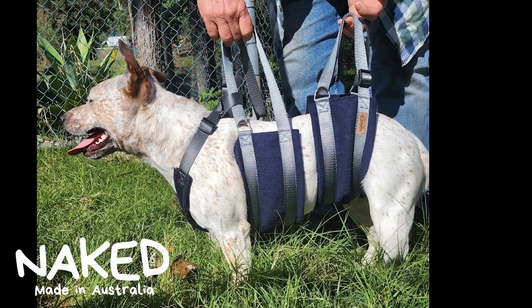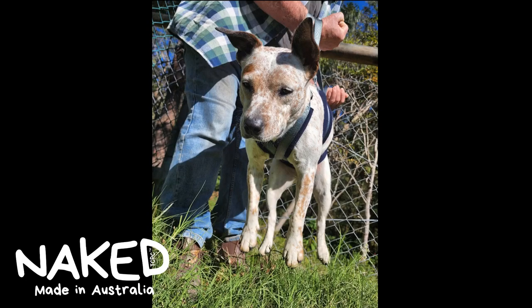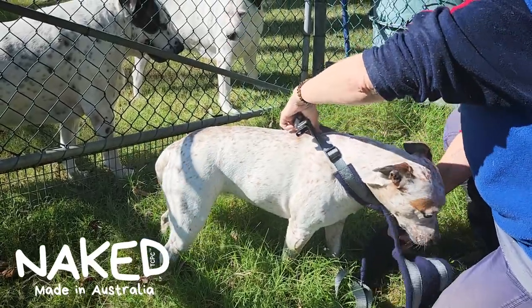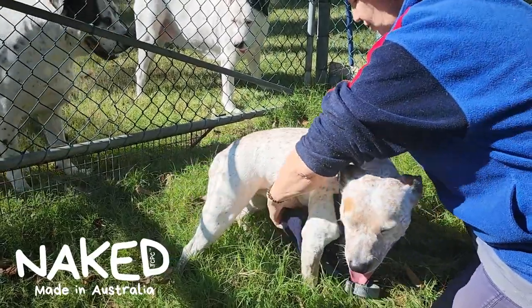Introducing the Naked Lift Harness. This harness is designed to give your dog a helping hand — they may have had surgery, or they may have arthritis or injuries. It's just an easy way of being able to help them up and down stairs, in and out of cars or furniture.